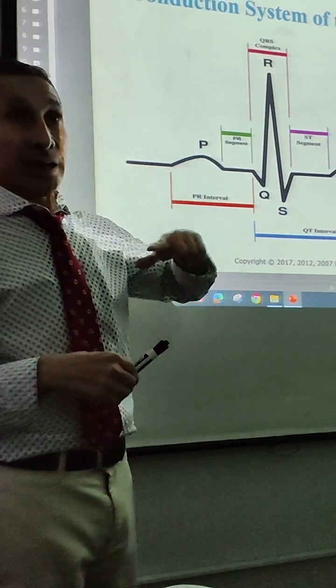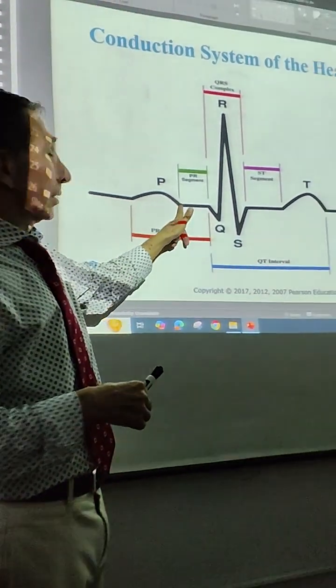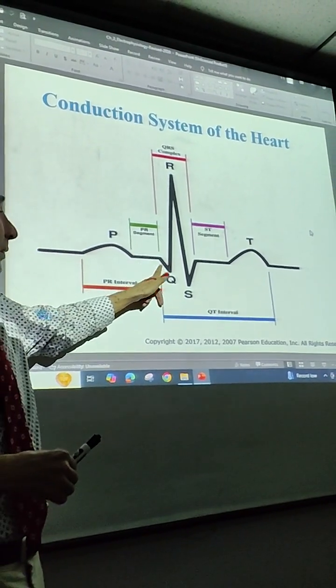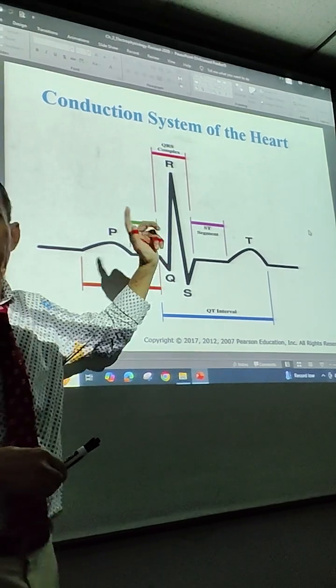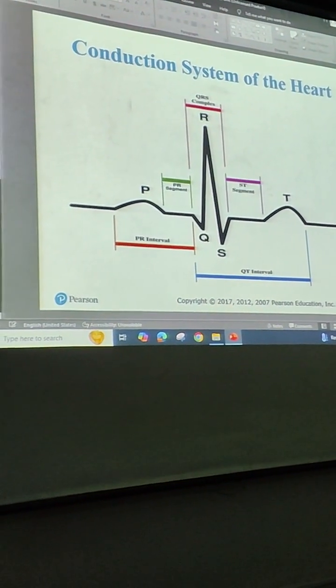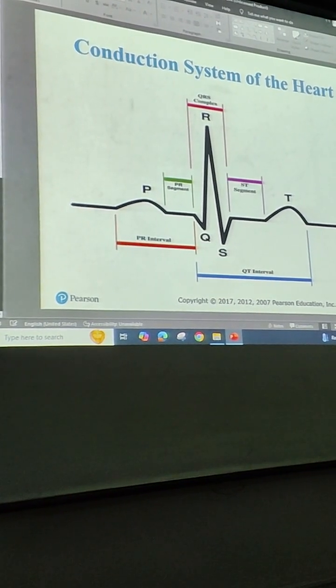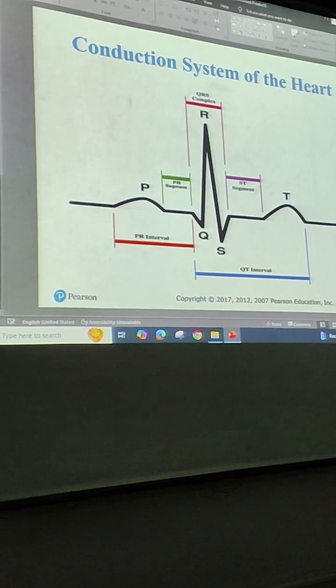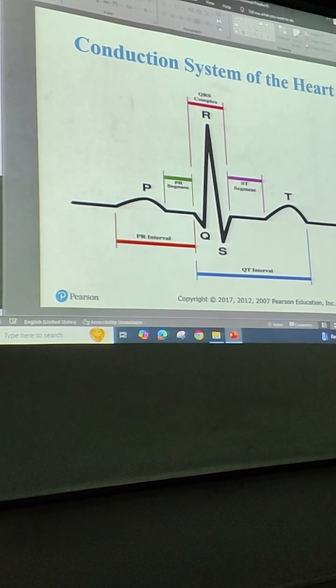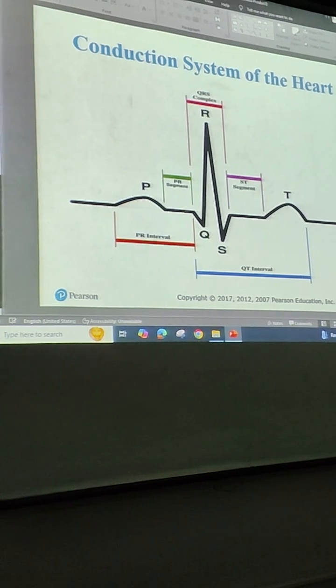It is the time in between the ending of the P and the beginning of the R. See? Just look at the PR interval where it's located. So if they ask you for the definition of the PR segment, there are different ways of finding the answer.